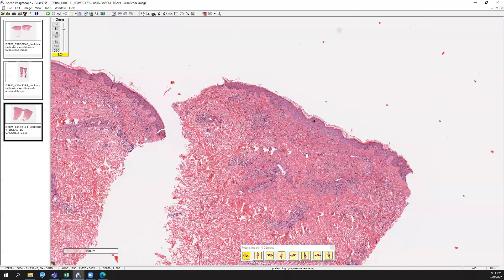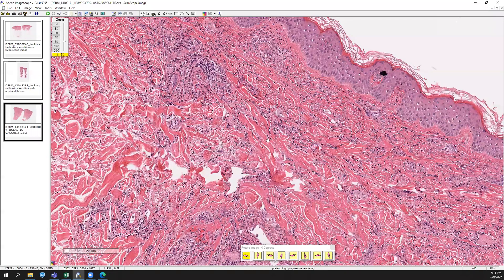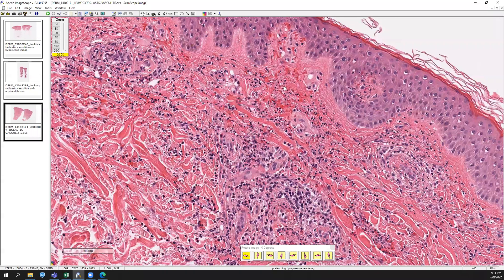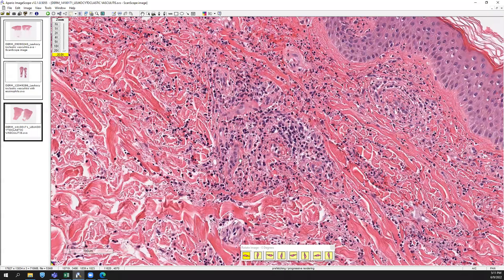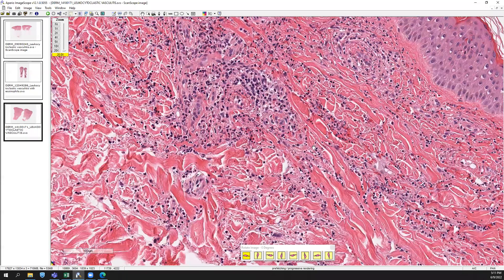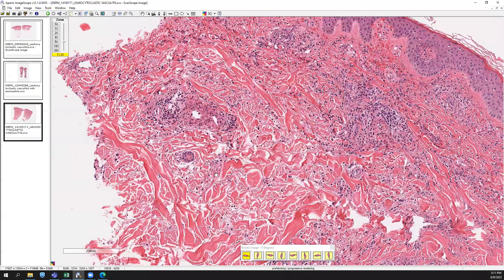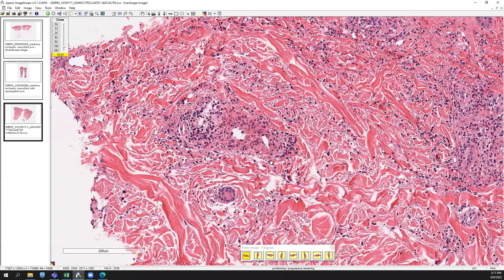Last but not least, just another example of leukocytoclastic vasculitis — just to hammer home the details. The key concepts are: extravasated red blood cells, small fragmented neutrophilic nuclei or leukocytoclases, and obscuring of the lumen with a hazy eosinophilic material, which is the fibrinoid necrosis. If you have all those features, it's safe to call it consistent with leukocytoclastic vasculitis, and if the clinical picture is looking for vasculitis, it's definitely leukocytoclastic vasculitis.